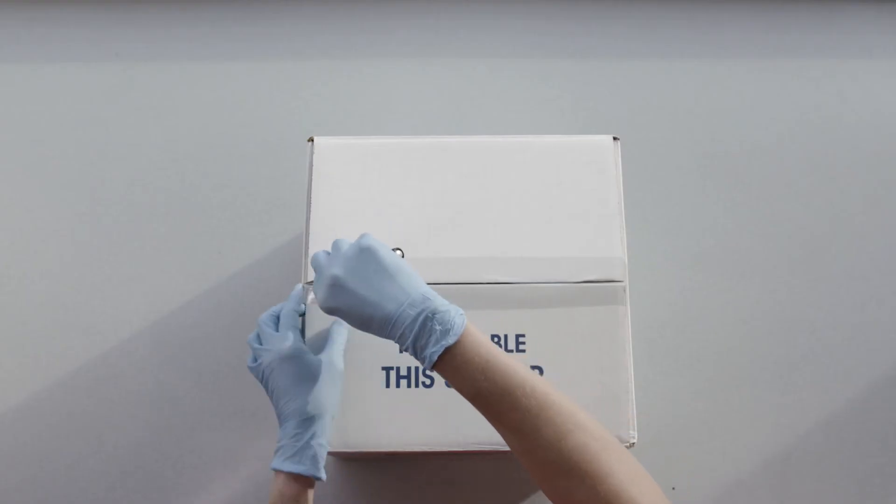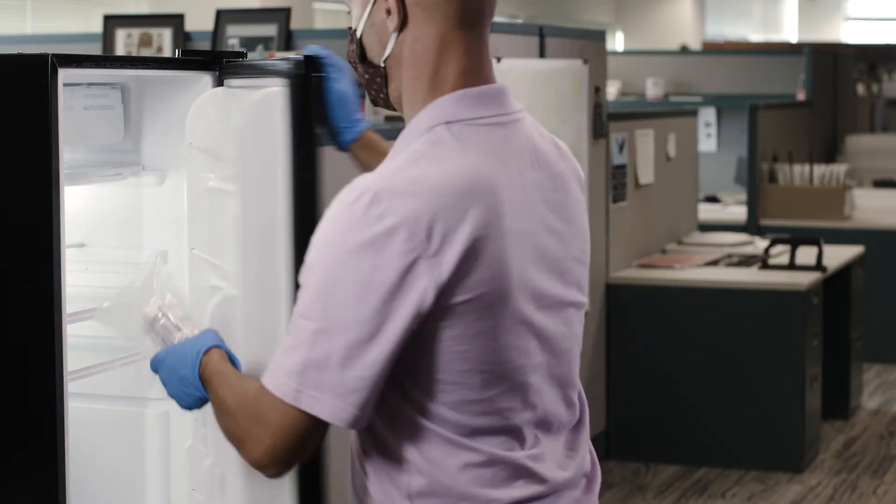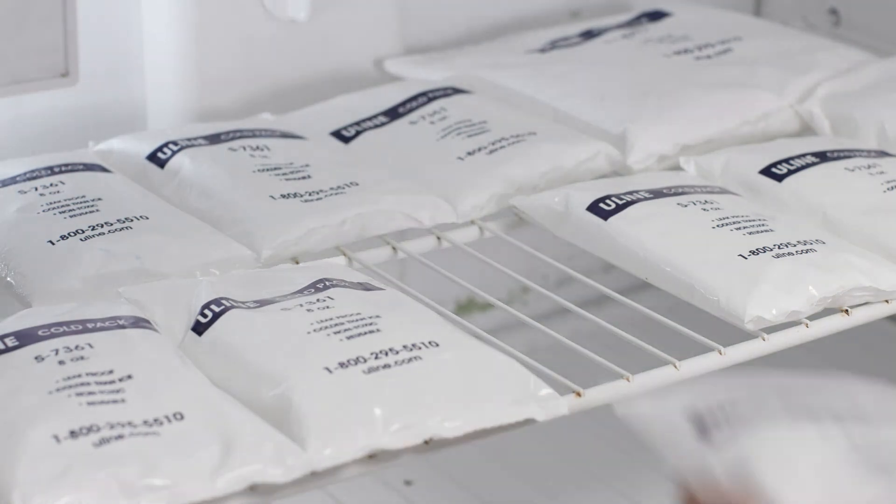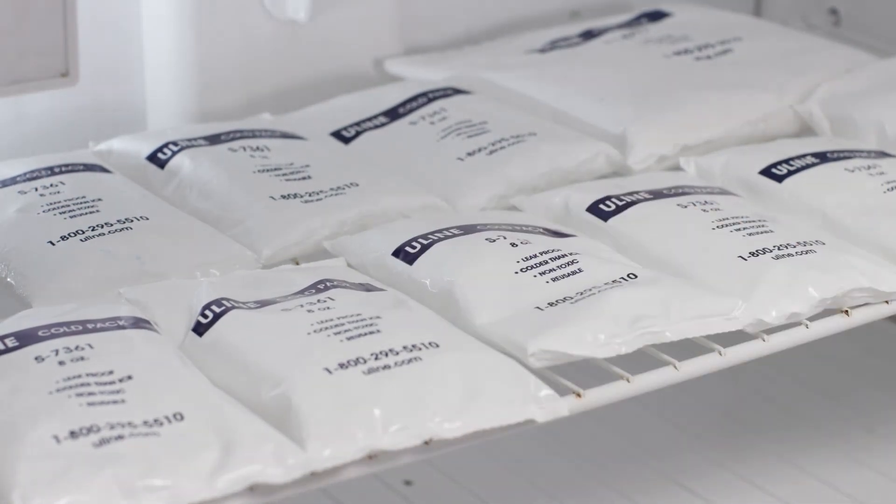Upon receiving your kit, you will want to open the package and begin by storing the provided swabs in the refrigerator and the gel packs in the freezer. Be sure to place the gel packs flat in the freezer. This will help keep your samples cold during return shipping.